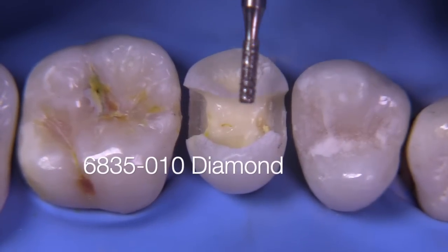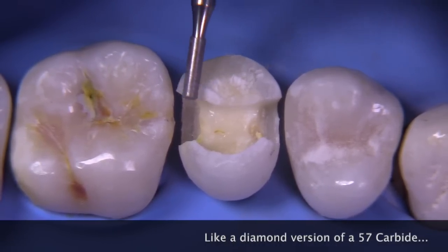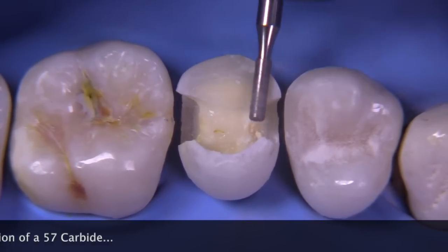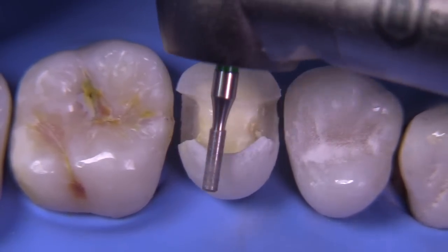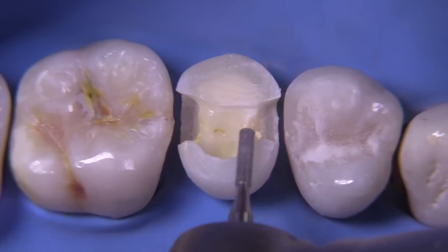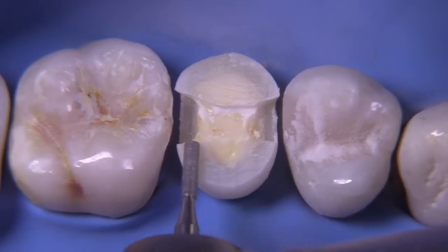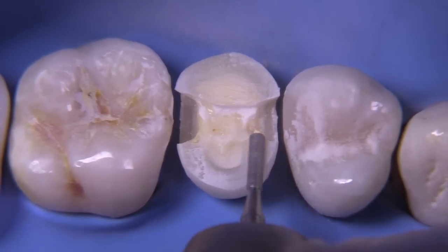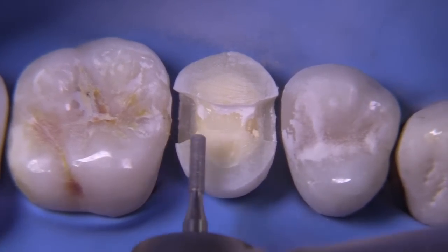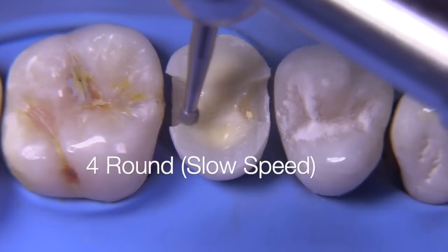For cusp removal today, I'm going to use a 6835 diamond. This is a millimeter in diameter — it's a lot like a 57 carbide but a diamond version. This is part of Brasseler's series on operative diamonds that can be utilized for cusp removals and preparations of all different types. The objective is to keep removing the cusp until we have approximately two millimeters of occlusal space for the composite, while also making sure that all remaining enamel is fully supported by good, strong dentin. Make sure that you remove all remaining caries at this point as well.